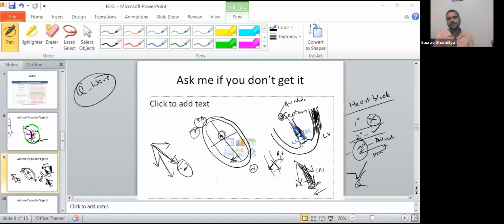Okay, not clear? Again, I'm telling you. As I told you, the AV node has bundle divisions, right? Left bundle branch, right bundle branch. You are very clear that left bundle branch impulses will pass through the septum. The right bundle also will go, but left has more potential, so it will suppress the right part. Actually, we'll not say the suppression of the right part. We'll talk about all the impulses having this resultant vector, and because of constant more potential from the left side, the resultant vector will have a negativity effect. It will have a suppression effect in general. Naturally, that's the reason we have a small Q wave downward deflection. Yes, left has more action potential.